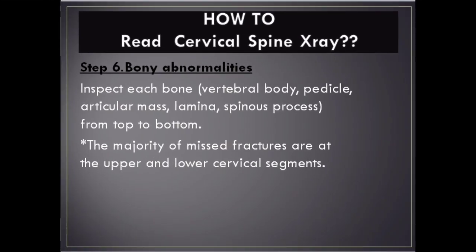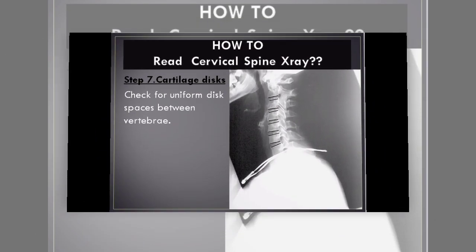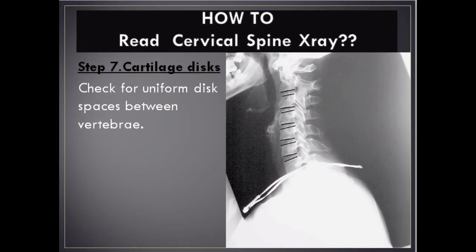Step 6 – Bony Abnormalities: Inspect each bone — vertebral body, pedicle, articular mass, lamina, and spinous process — from top to bottom. The majority of missed fractures are at the upper and lower cervical segments.